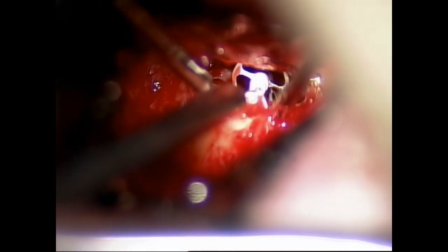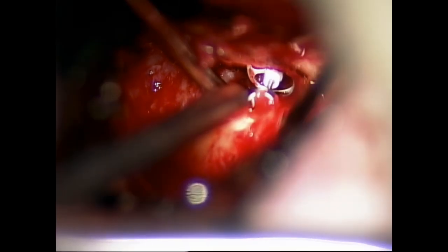So here's the endoscopic view. I've lasered and cleaned up the undersurface of the cartilage. Now I'm going to check the mobile segment of the cartilage to make sure that we don't put the head of the PORP under the annular bone. It's a little more shallow middle ear space than the previous case.